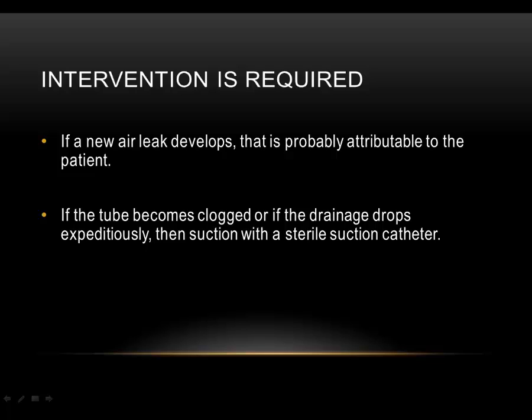Studies show that drainage from the pleural space is impeded when tubing has a dependent loop. Ensure the tubing is straight or loosely coiled for optimal drainage. Drainage accumulating in the tubing will impede suction. If there is no way to position the tubing as described, physically lift the tubing and empty drainage into the device every 15 minutes or as it accumulates.